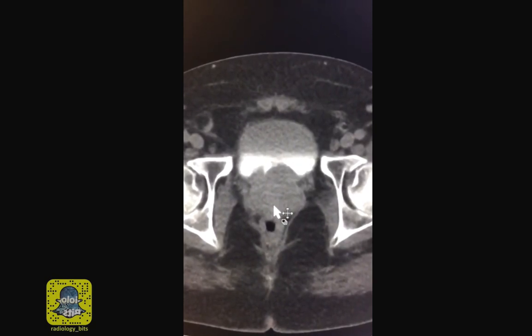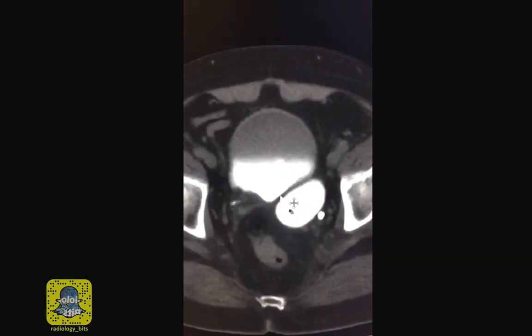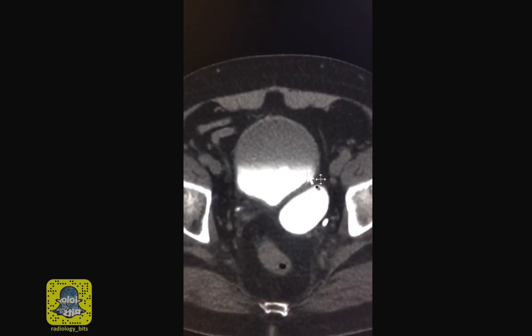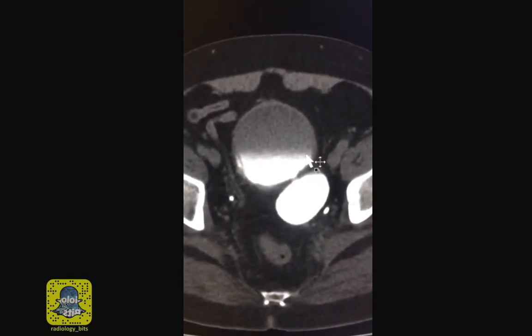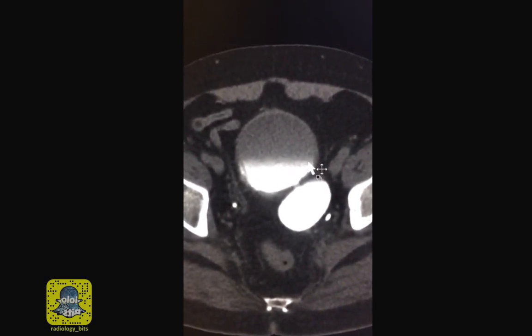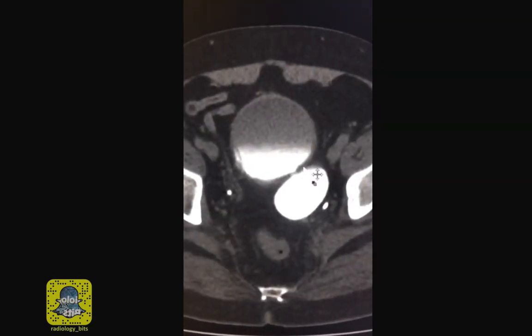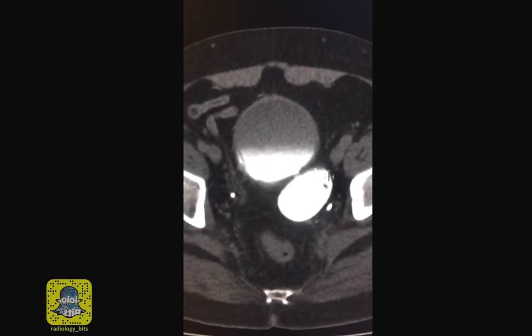Which is a result of increased pressure within the urinary bladder, commonly due to enlargement of the prostate in the context of benign prostatic hyperplasia. From this case you learn that if you see an abnormality, make sure it does not connect or relate to adjacent structures — that helps with your differential diagnosis. You also learn that assessing the density is of great help, knowing if the lesion is of fluid attenuation, soft tissue attenuation, or even both. Enhancement in a lesion is a good indicator of a soft tissue component, which was not present here.